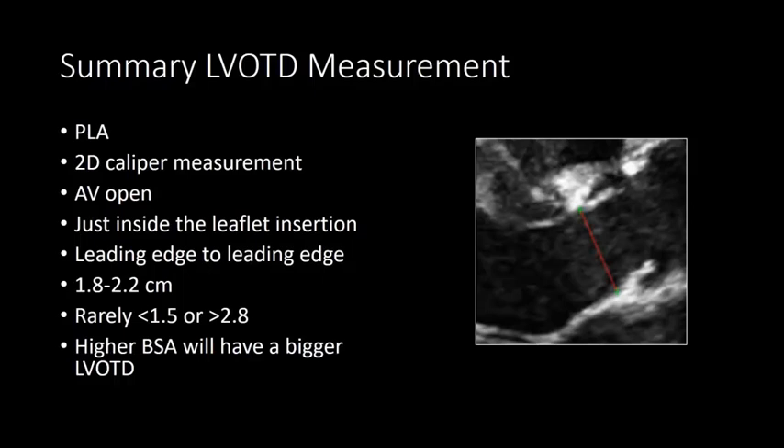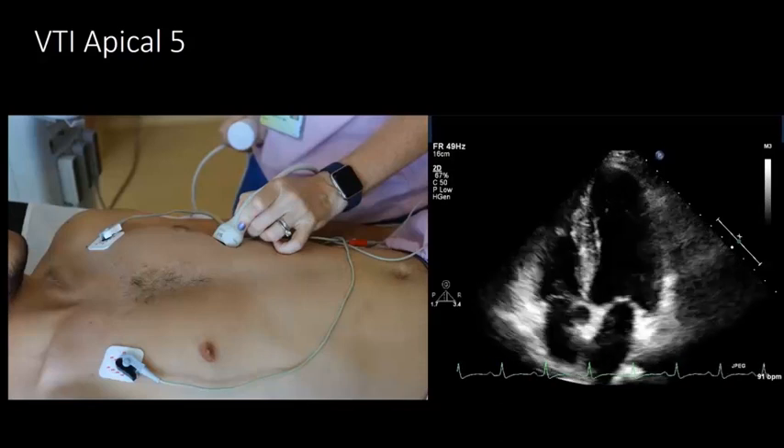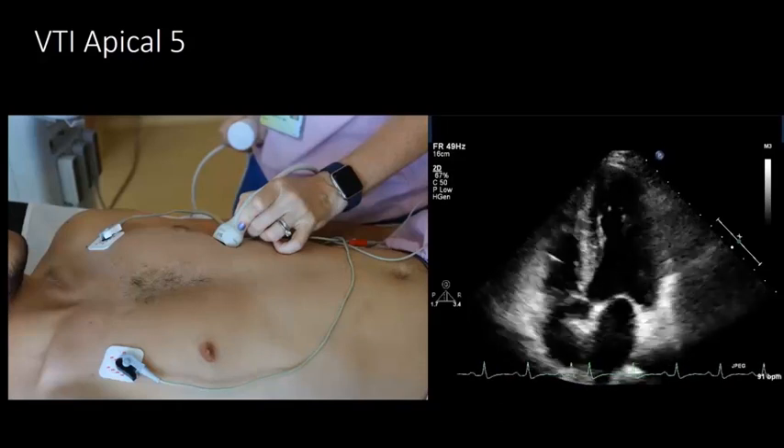In summary for the LVOT diameter measurement: obtain it from the parasternal long axis view as a 2D caliper measurement when the aortic valve is open, just inside the leaflet insertion, leading edge to leading edge. Normal values are between 1.8 and 2.2 centimeters — it's very rarely less than 1.5 or greater than 2.8, so if you get those values you may want to remeasure. Patients with higher BSA will have a bigger outflow tract diameter.